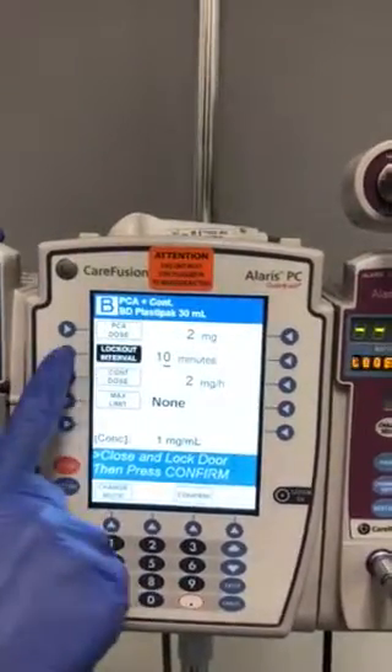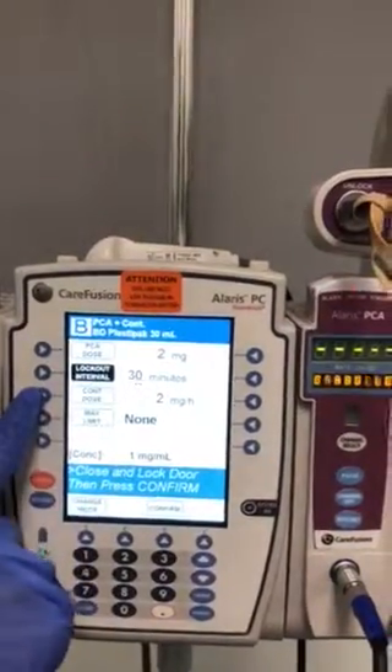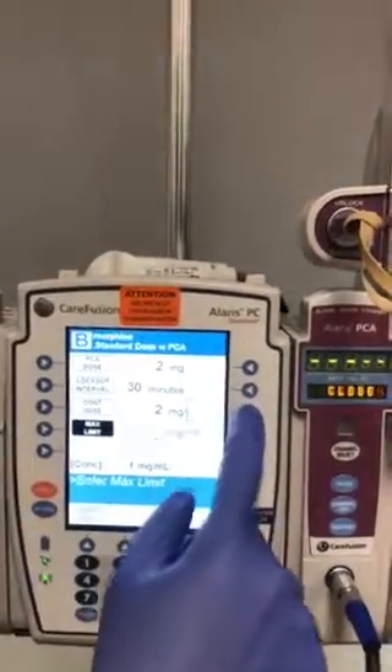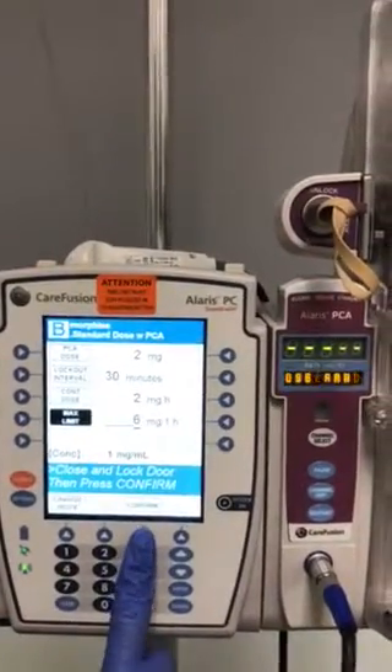We just received new orders to change this to a 30-minute lockout interval. Our continuous dose will stay the same, and we did get a max limit of 6 milligrams within an hour. We will confirm that this is correct.